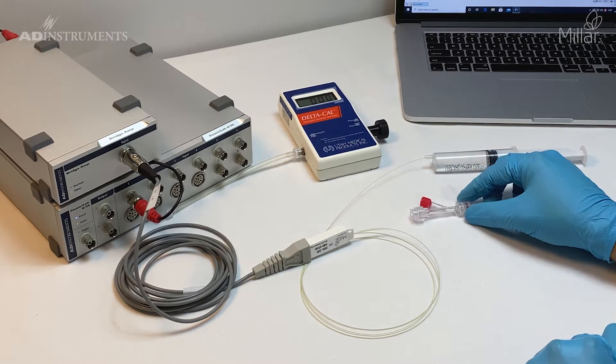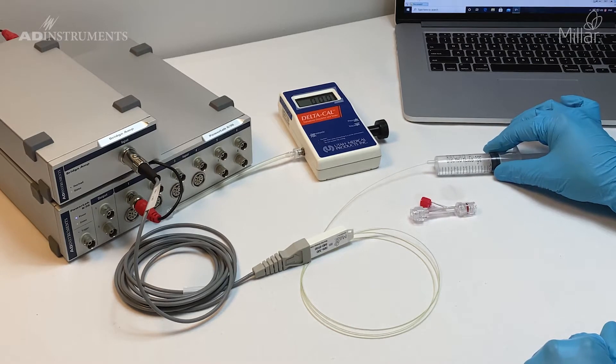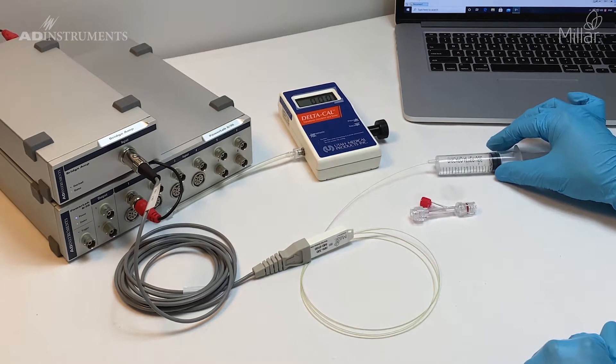The catheter needs to be soaked for at least 30 minutes in 37-degree saline.